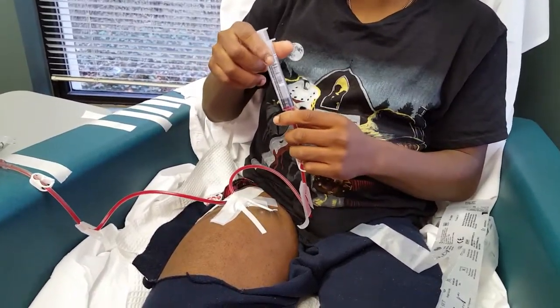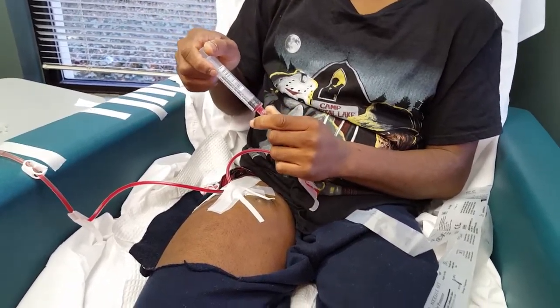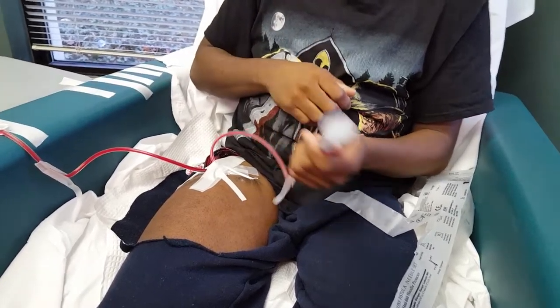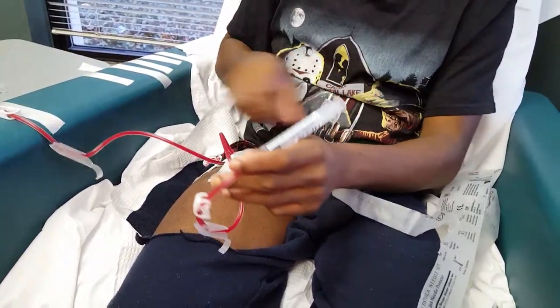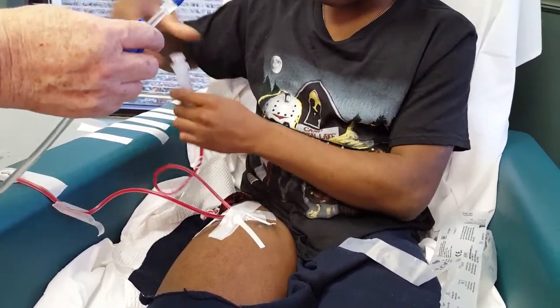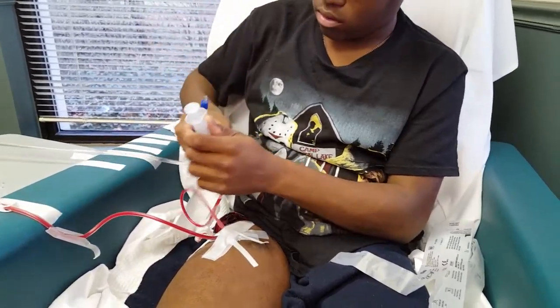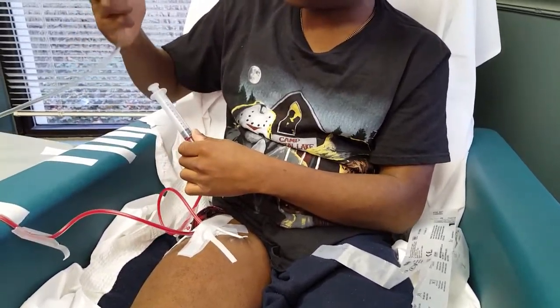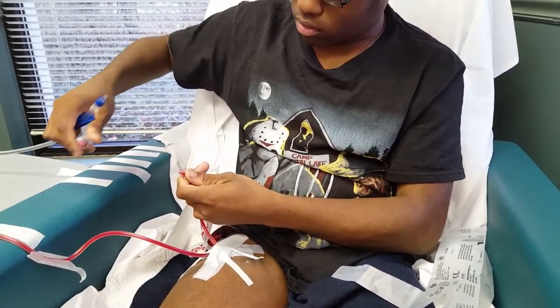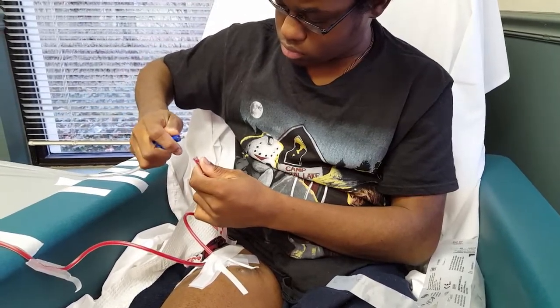Now are we ready? Not until you get the other one hooked up. Well, you have to give me the blue line. Hang on a minute. Got to be careful not to touch anything. Throw this one up here. Then this one's the venous. This one returns. You still got it on there? Yeah, she's doing a good job of videoing you. Let me put that one over there.